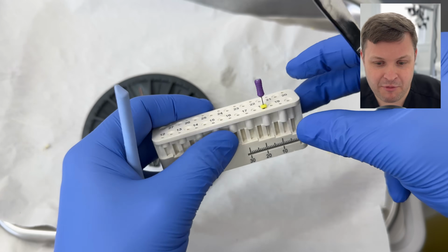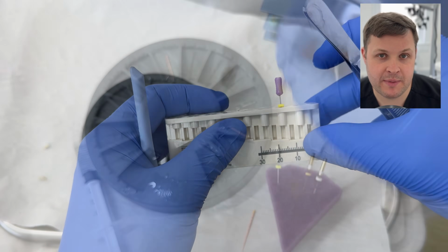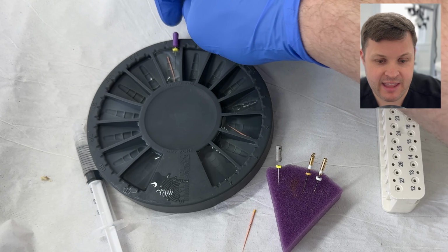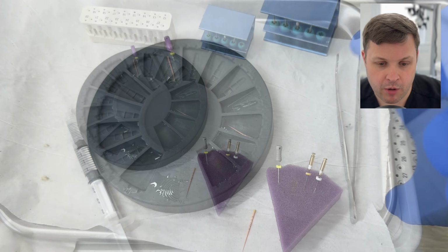We're then going to get a hand file. We're going to measure it to about 18, maybe about 2 or 3 millimeters away from the working length, and then we're going to disinfect that because we're going to use that later for our obturation.